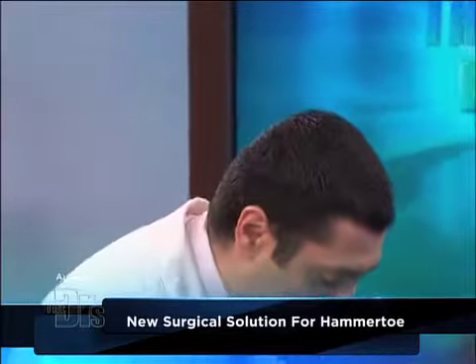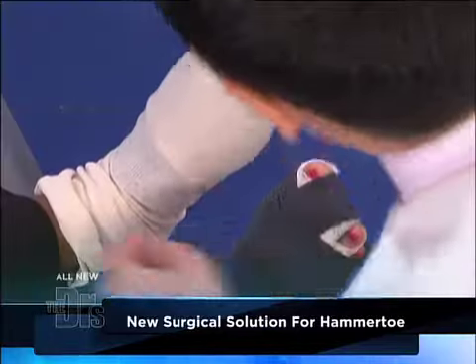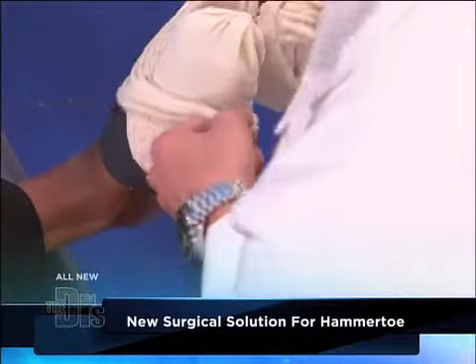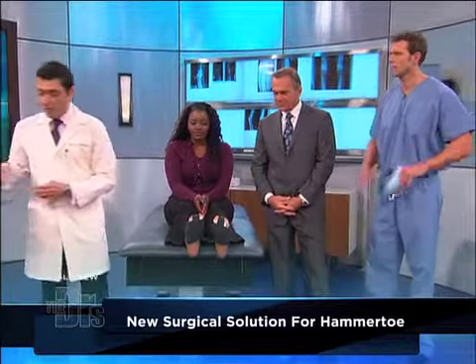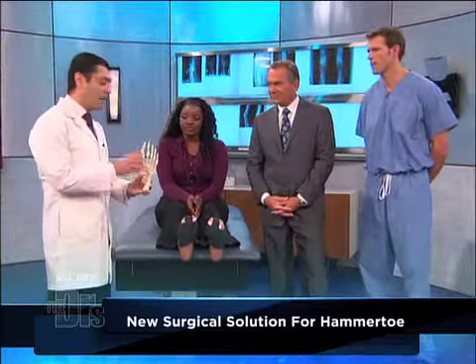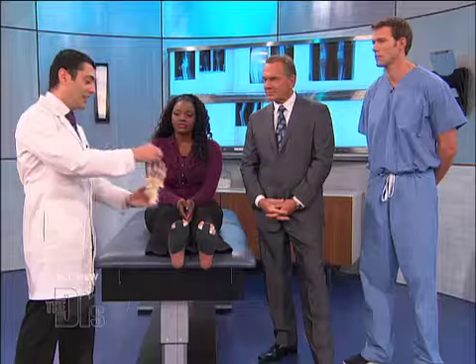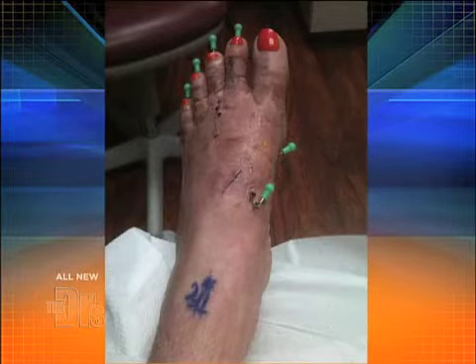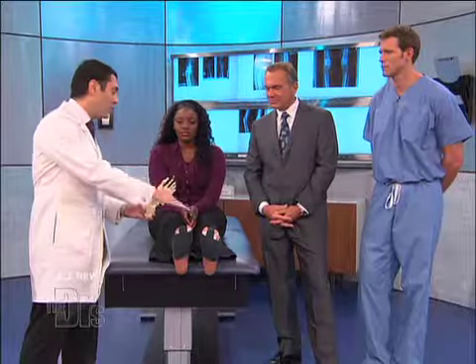If we take a look at her dressings, what you can see is that the procedure doesn't involve anything protruding from her foot. The traditional way of doing these things, we use something called a K-wire. And a K-wire is a device that holds the bones together while they heal. The difficulty with this is the patient has a 6 to 8 week recovery before this thing heals, and this thing is sticking out of her toe and has to come out. So it's kind of unsightly, it's difficult because it can bend, it can break, it causes infection. So this K-wire process has been eliminated with this new technique.